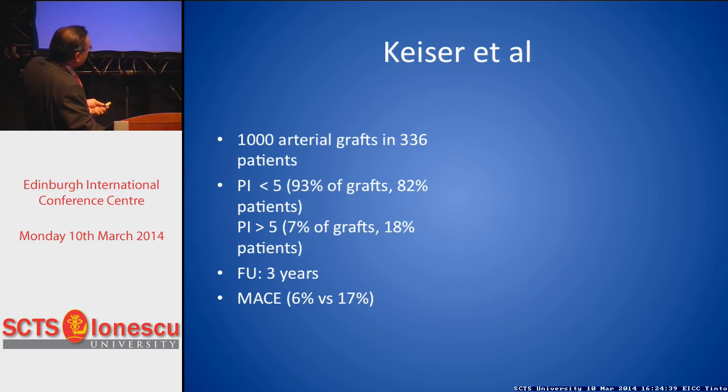And they found that pulsatility index correlated very well with MACE. They followed up their patients for 3 years. The patients who had a low pulsatility index had a lower incidence of MACE, 6%, compared to 17% MACE for patients who had a higher pulsatility index.